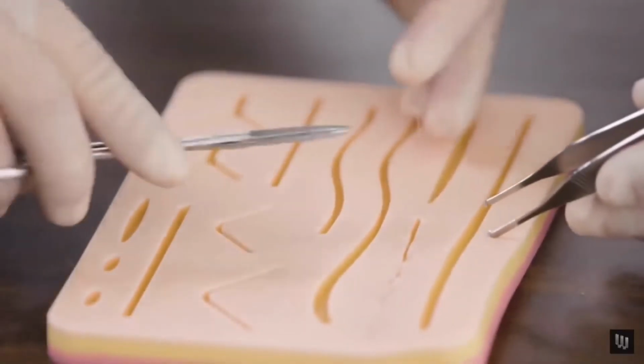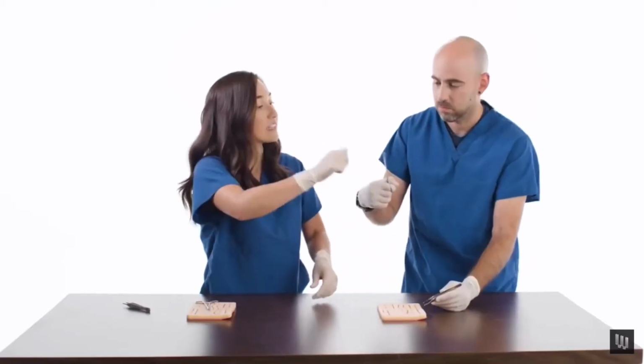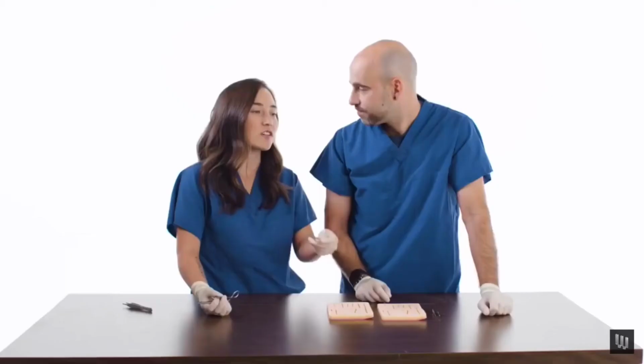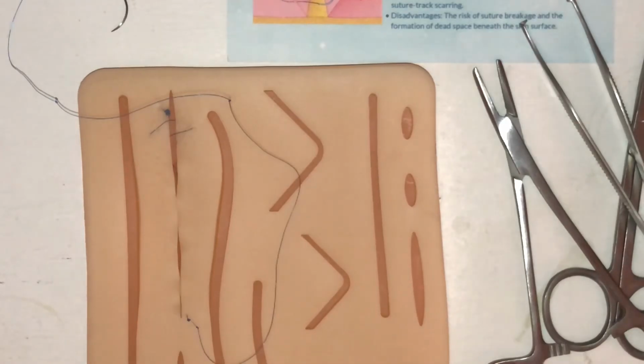Then your assistant cuts this, and once you're done with the suture, you pass it off to the scrub, protect it, and you say needle back. Needle back. Look how nice, look how beautiful that is, the thing you did 80% of. The point of this is that the suture is hidden, so they don't need to get them removed, and they just dissolve. All right, so that was way tougher than I thought it'd be.